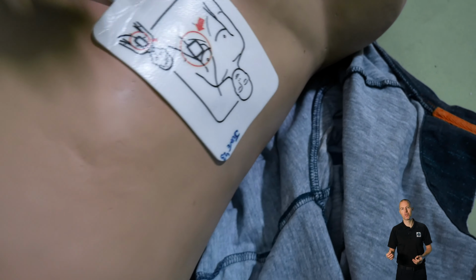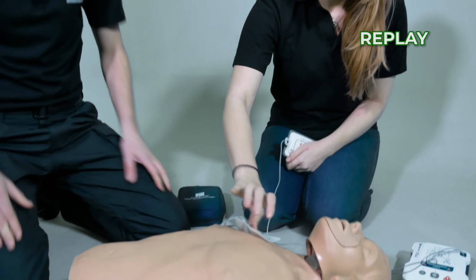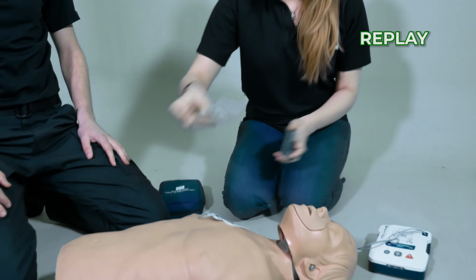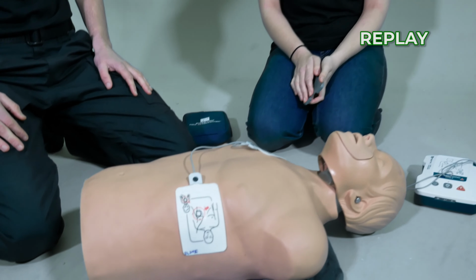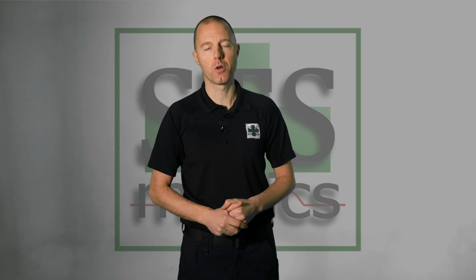Listen to the instructions. The device will analyse the heart rhythm and you will have to pause compressions. It will then decide if the patient needs a shock. If the patient does not need a shock, continue with CPR. If they do need a shock, then press the button when instructed. The device will reanalyse the heart rhythm every 2 minutes and you may need to shock the patient multiple times.